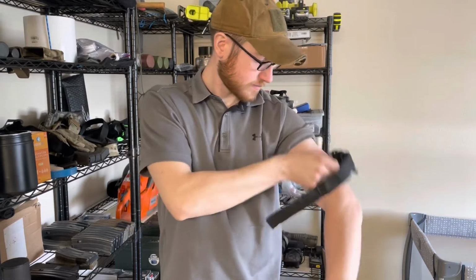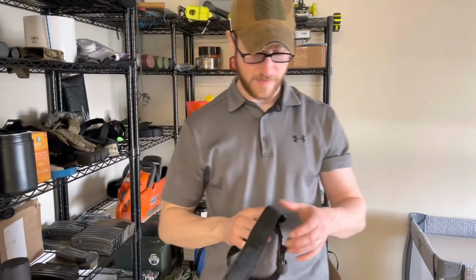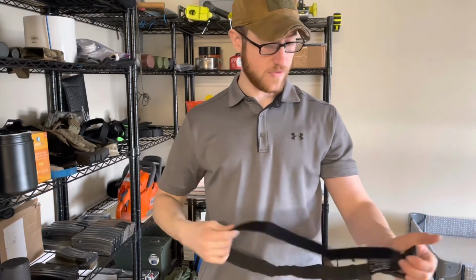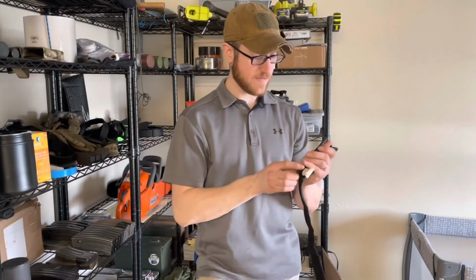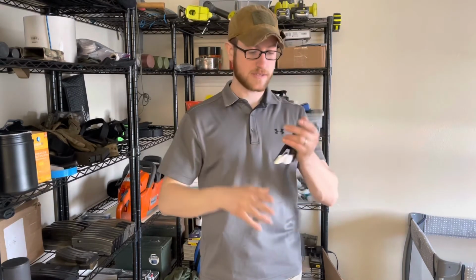So now a note on placement of a tourniquet. While we have the camera up here, we'll talk about that really fast. It's traditionally taught to put tourniquets high and tight. The reason this is taught is because the tourniquet is the only intervention, at least this is what I was taught, the tourniquet is the only intervention you're going to do on the X.